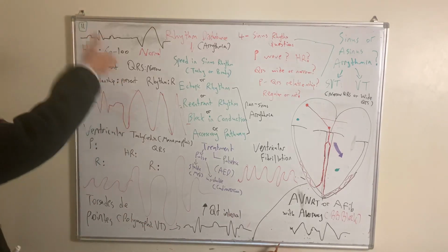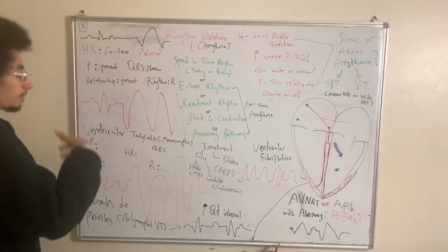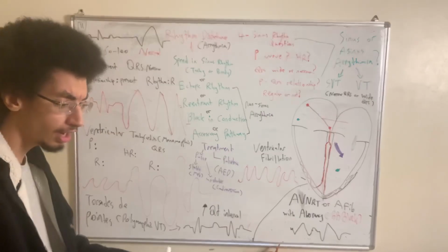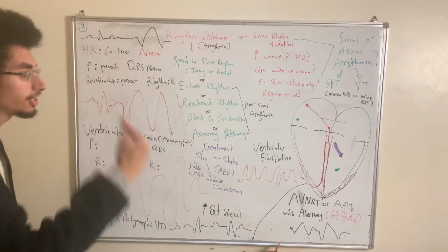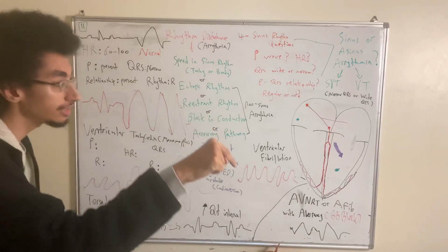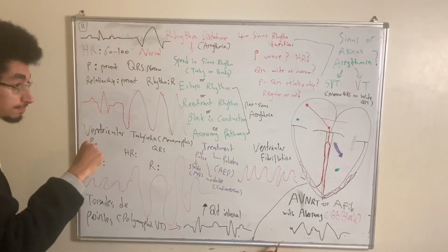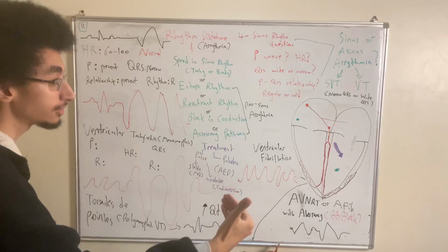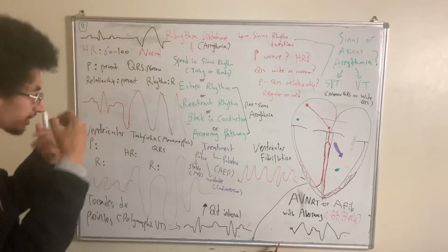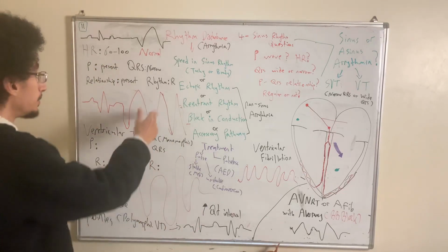Well, in the world of EKG, there's something known as the rules of malignancy for a PVC. In most cases, a PVC might be harmless. It may be benign. But there are certain scenarios, certain criteria, which can conclude that a PVC can be malignant, it can be dangerous, it can convert itself into a ventricular tachycardia. So we can assume this as the benign form of ventricular tachycardia. And when it becomes malignant, it is truly ventricular tachycardia. So what is the criteria? What are the rules of malignancy that state, if you see this criteria, the PVC is dangerous.